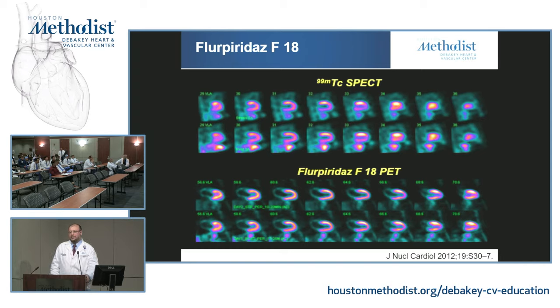So there have been some attempts to do this, and the protocol we will image the patients on will potentially allow us to get CFR. But again, it requires some validation. So the prior trial, the data was analyzed, and they could measure some CFR in there. It was just presented a few weeks ago.